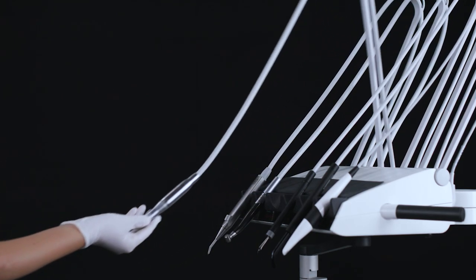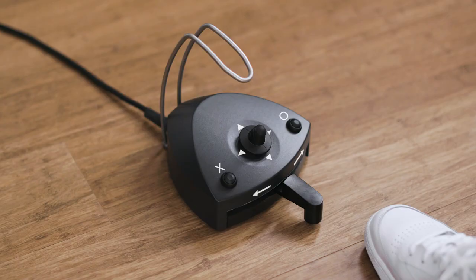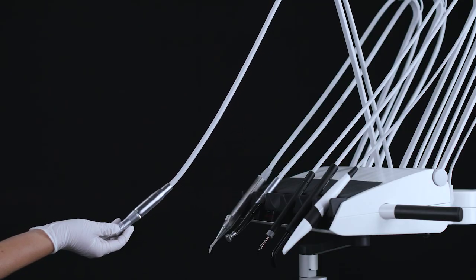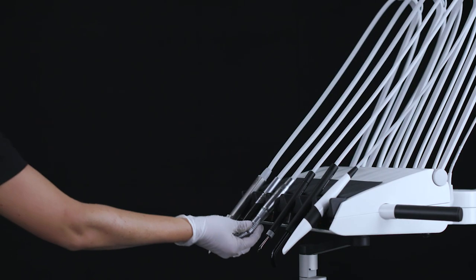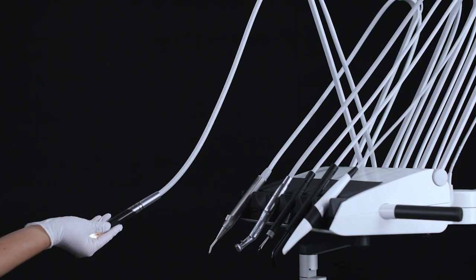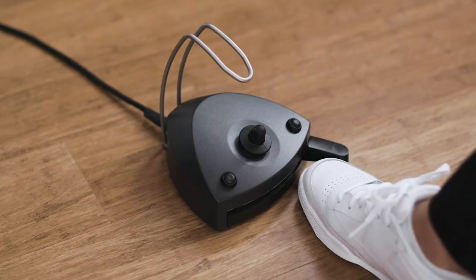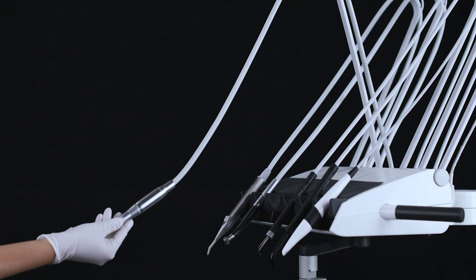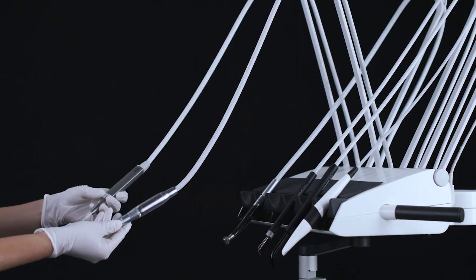You activate the first instrument by lifting it forward with the foot control pedal. To avoid unintentional activation and lifting forward of a second instrument, you are only able to activate the second instrument after the first instrument has been returned to the rest position and the foot control has been released.